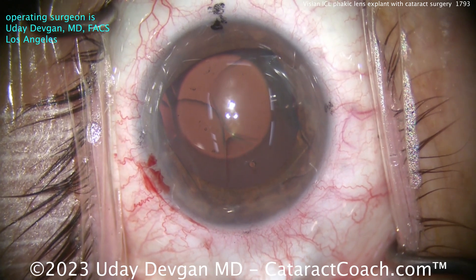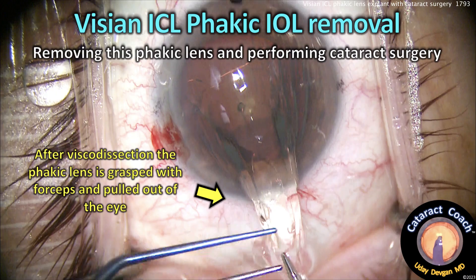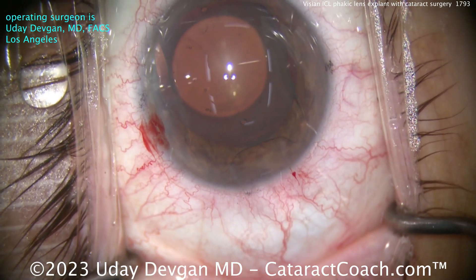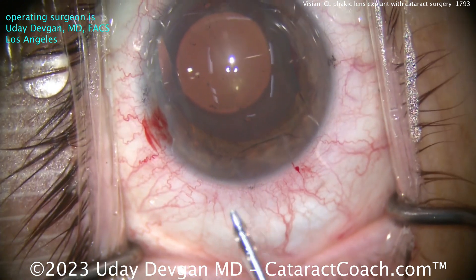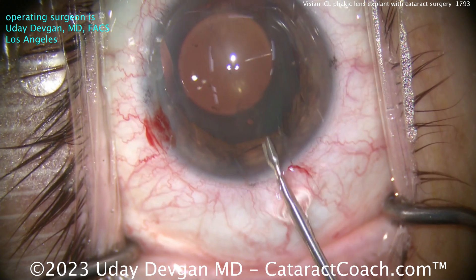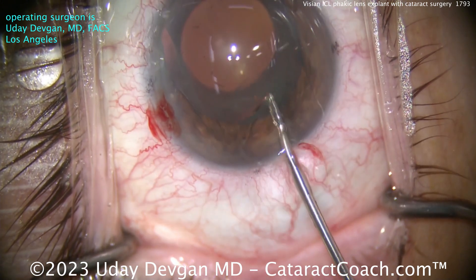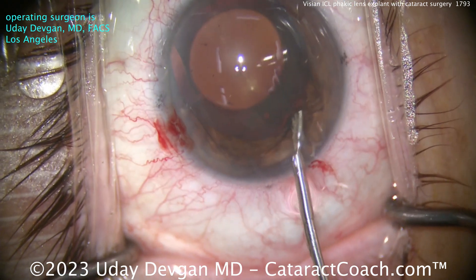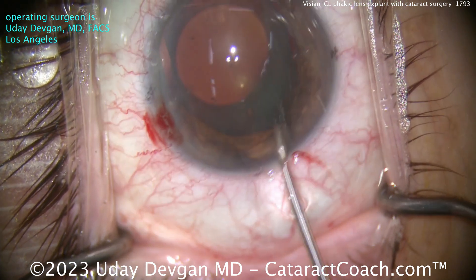We'll use plenty of viscoelastic to help lift that up. The goal is to use forceps to grab that ICL — it's so soft and flexible, you can pull it right outside the eye. More viscoelastic going in, plenty of OVD, dispersive viscoelastic. Now using these micro forceps, you want to be able to grab that lens and make sure you get a good, strong grasp right there in the middle somewhere, and then you can just pull it right outside the eye.